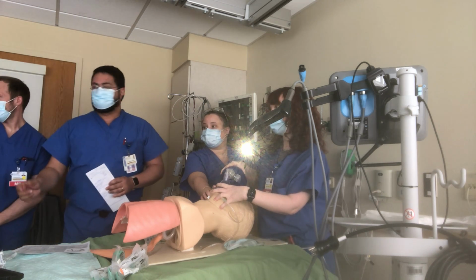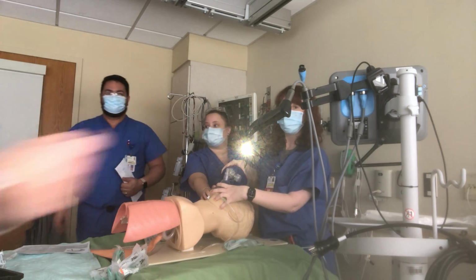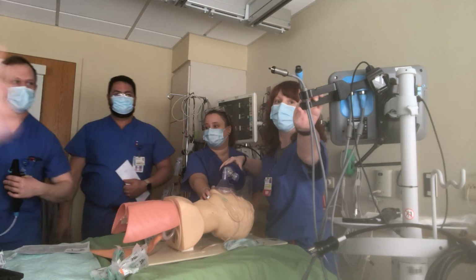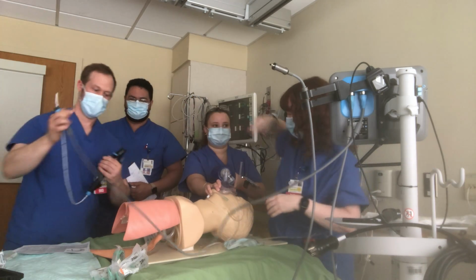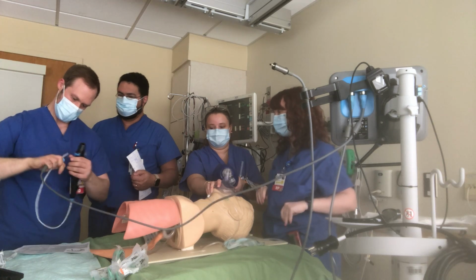Yeah, let's get that, and then please connect it. Not here, not here. The other one. How do we get it out? Oh, there we go. Right to the top. Yep, thank you. Maybe USB port.